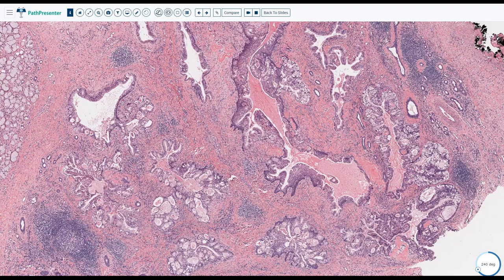It's not just you saying that. It means you looked at the cystic component, the mitosis, the necrosis, the anaplasia, anything out of the ordinary, and you have to describe that. If you have significant mitosis or necrosis or anaplasia or pleomorphism, you have to describe all of it. If you say low grade, it means you are satisfied with the components that you have. Okay, all right.